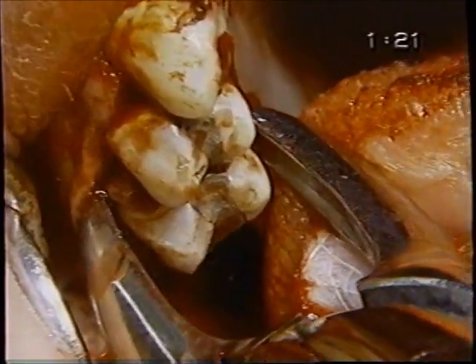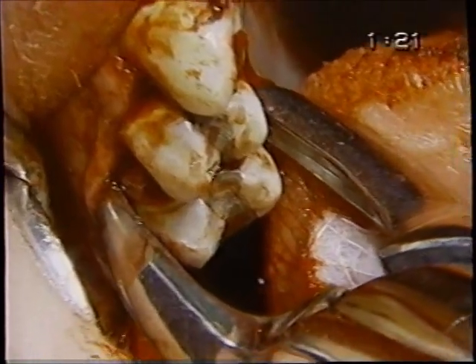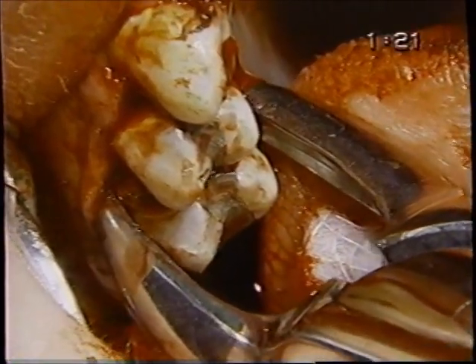And we've got everything. I'm going to skip that first molar and go to the second bicuspid, mainly because it will give me better visibility for that badly decayed first molar. Again, buccal, lingual.